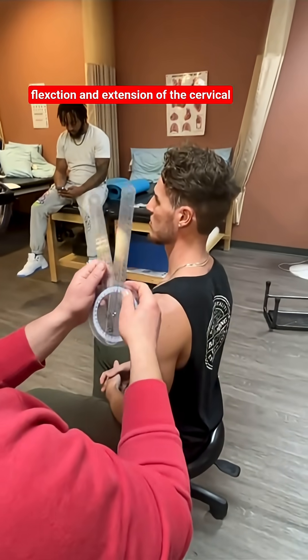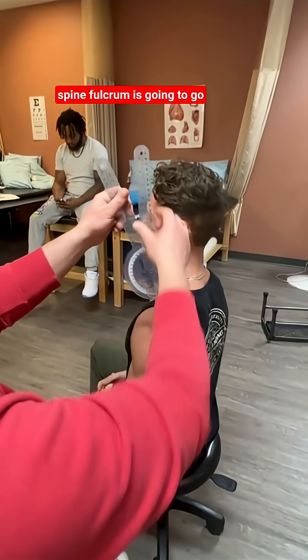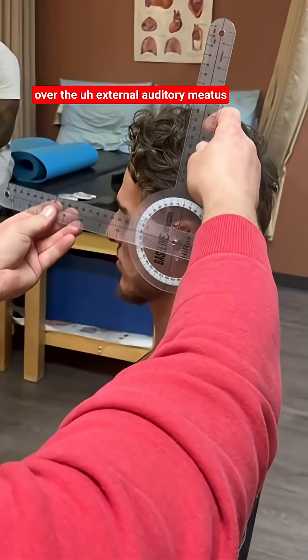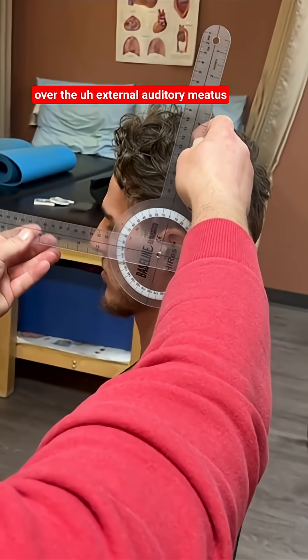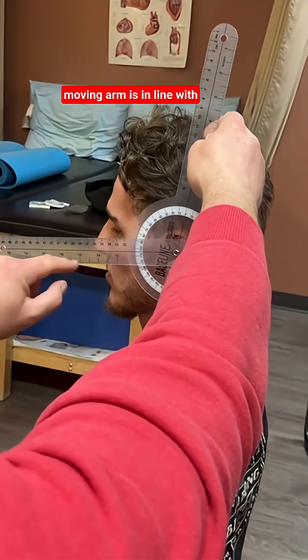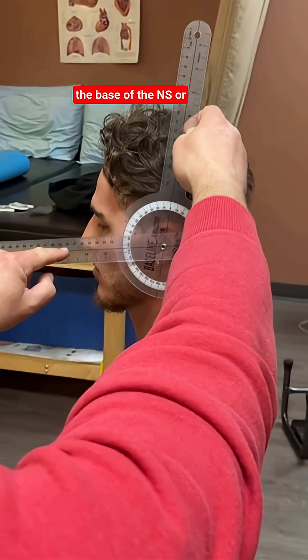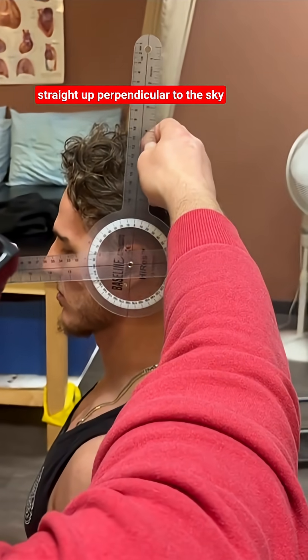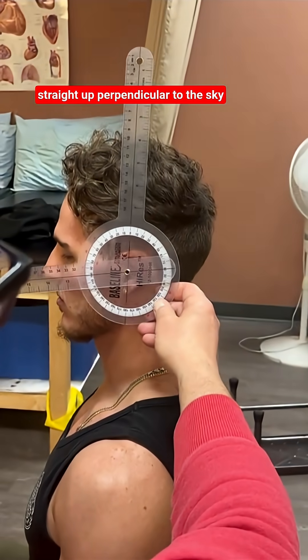Flexion and extension of the cervical spine. The fulcrum is going to go over the external auditory meatus. The moving arm is in line with the base of the nares of the nose. And this is going straight up, perpendicular to the sky.